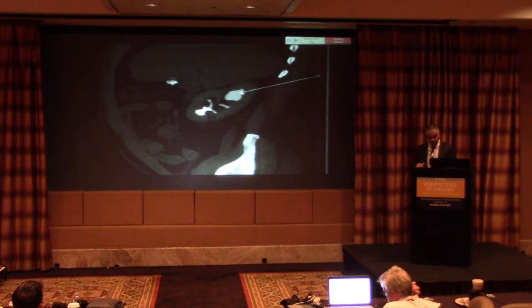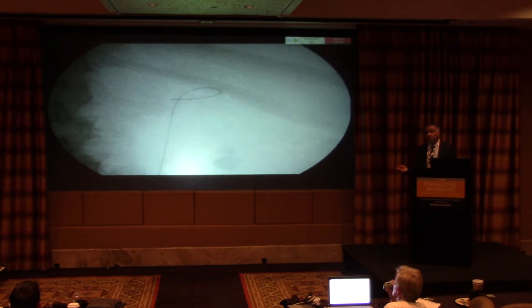So the patient goes to sleep on a gurney. Then they go prone. Nothing's done on the gurney. It's all done in a prone position. Women, rigid cystoscope to access the bladder. Men, flexible cystoscope. The ureter orifices will be up top, and so it's important to get all the air out of the tubing. If you go in with air in the tubing, it'll rise to the trigone and make it more difficult to find the ureter orifice.